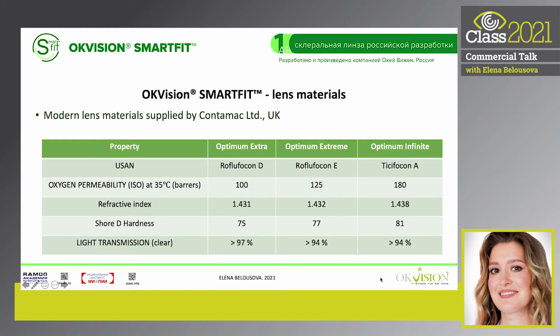And you can choose for your patient the higher oxygen permeability in a very difficult situation when you work with a patient, in some cases with corneal dystrophy.